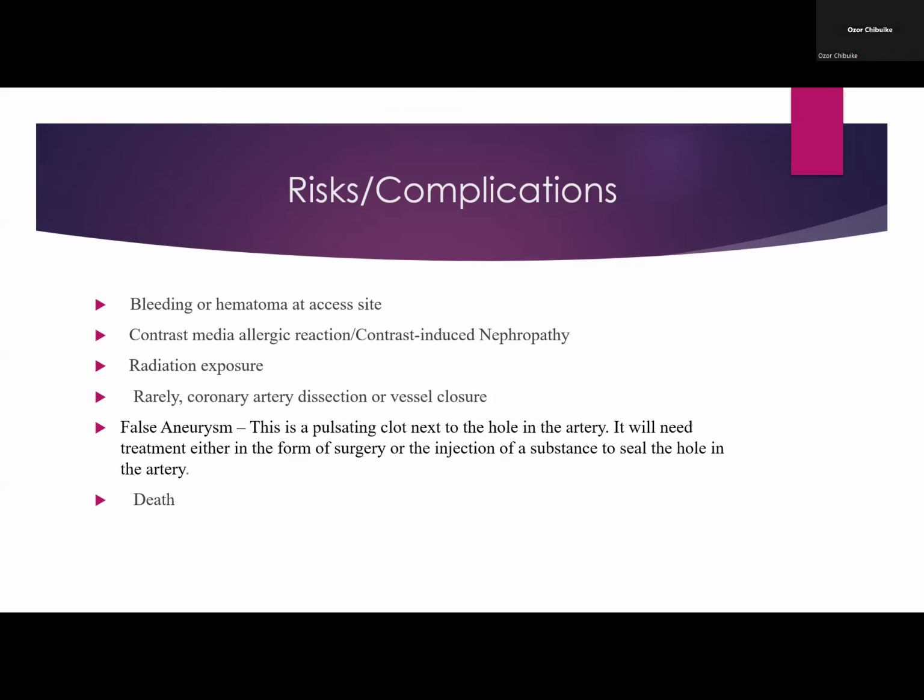And it is in this situation that the non-ionic contrast media finds good use. However, one of the problems with the non-ionic contrast media is that they are more expensive. However, they are usually of lesser osmolality and have a lesser chance of causing contrast reactions or contrast-induced nephropathy.